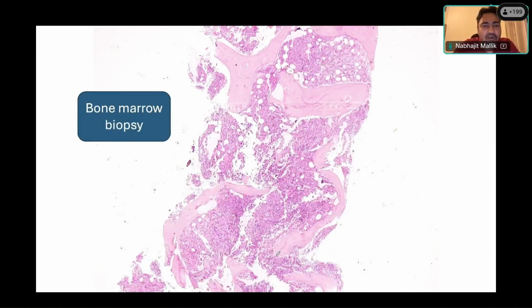Bigrai, what do you see in the bone marrow biopsy? First thing. Sir, the adequacy we will have to see. Right. How do you define adequacy in the bone marrow biopsy? Sir, minimum 8 intertrabecular spaces have to be present. Okay, 8 to 10 intertrabecular spaces.